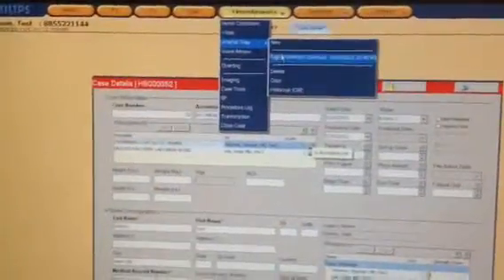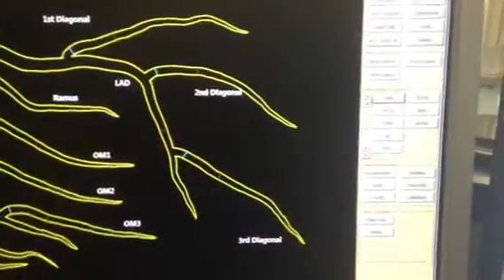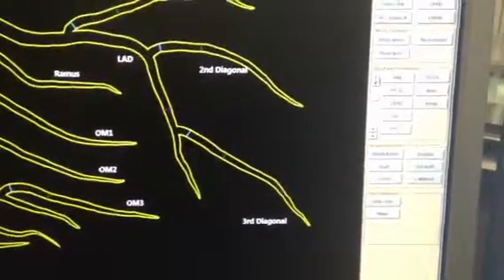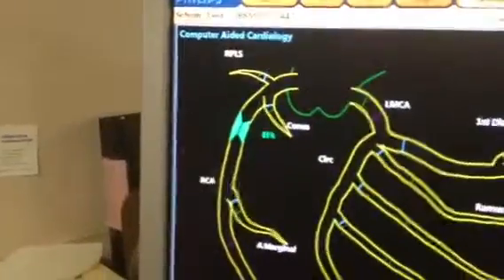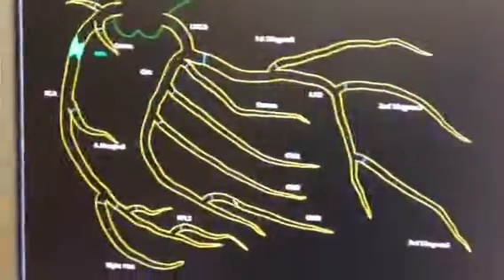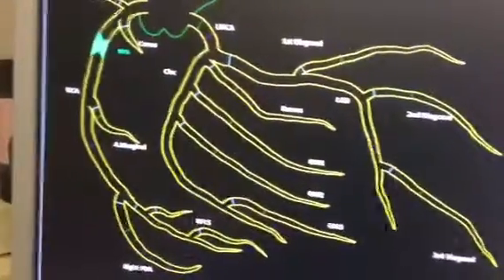When he's finished with that part, you go back to the screen. The images will be there. He'll make his tree. Put a little lesion right here. The outside buttons make them go up or down by 5. So we'll say that this lesion is 90%. That's the only lesion he has. He's got pictures. He has his tree.